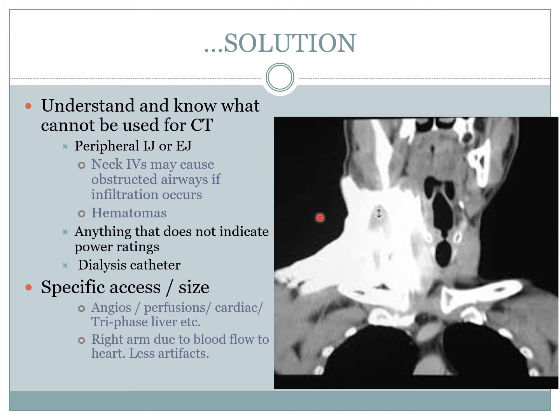Never, ever, ever use the IJ or the EJ in the neck. That's just a no-no. And you can see why. All right, so we went through that. A dialysis catheter is just for dialysis. We don't use it.